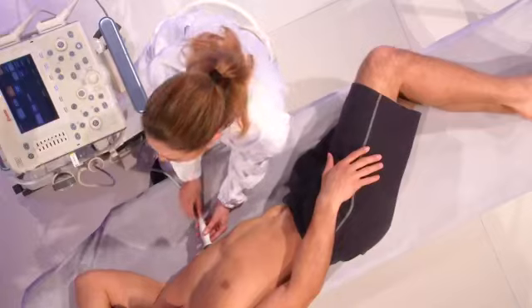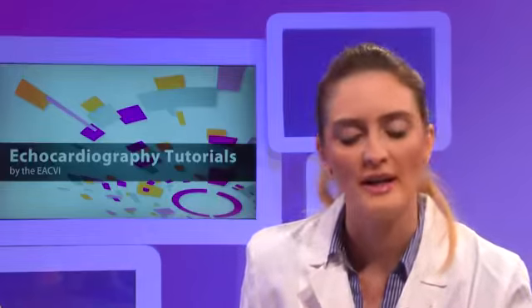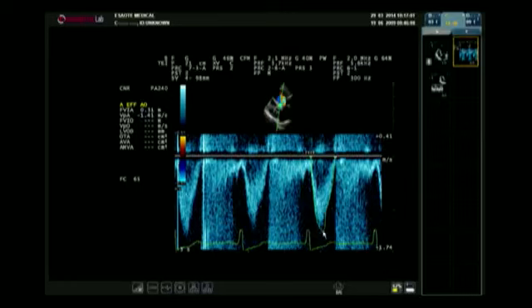So, in critically ill patients, it's also important to have a non-invasive estimation of stroke volume, and you can get it by assessing LVOT, the left ventricular outflow tract diameter, and the time velocity integral by pulsed wave Doppler, like this. And this is important because you can assess changes in stroke volume.